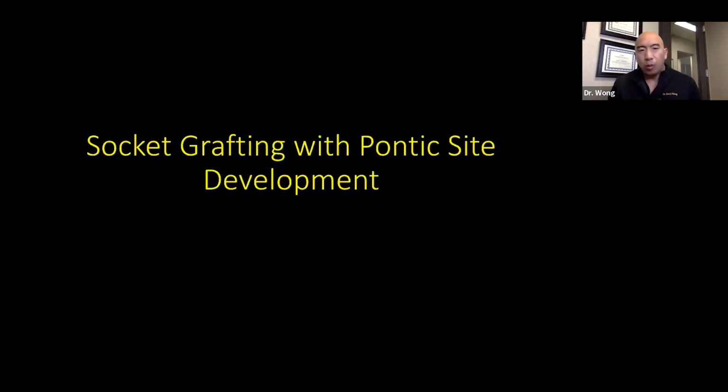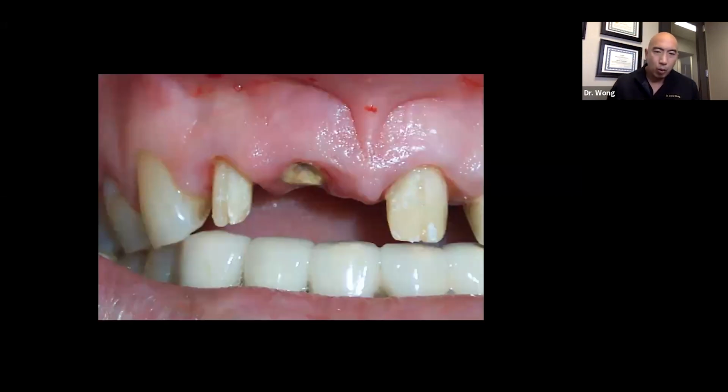Now, I'm in Tulsa, Oklahoma. There's a lot of times where we just still do bridge work. So if we're doing bridge work, does that mean we don't graft the socket? The answer is no. We still graft the socket. And the reason we do that is so that we can develop the pontic site so it looks good. So how do we do that?